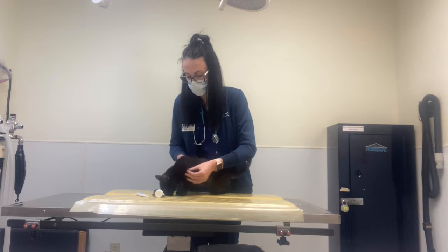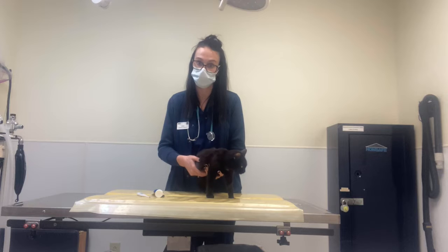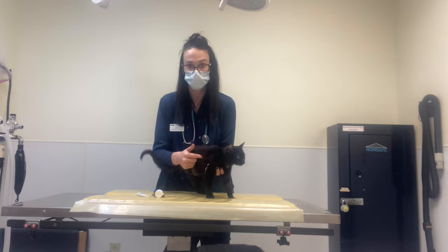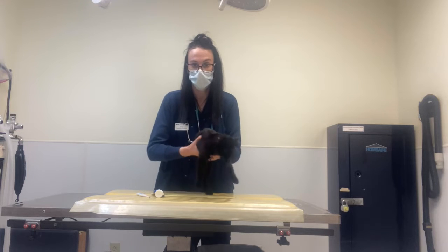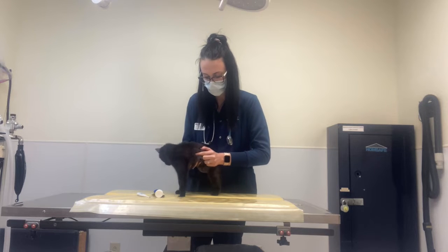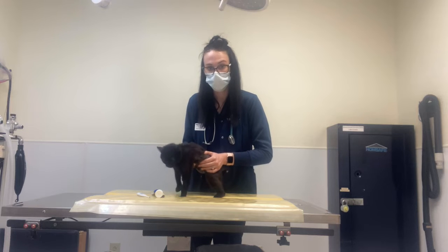For the lungs, for small dogs and cats, you go in an H pattern. That means right behind their shoulder, then in the middle, and then up into the bottom. Same thing on the other side.